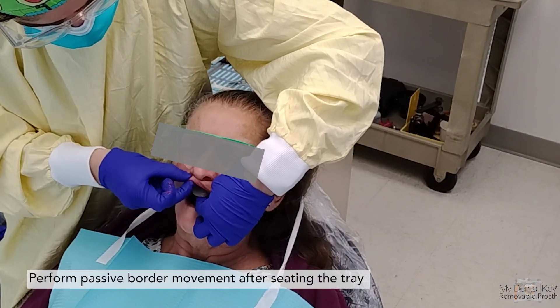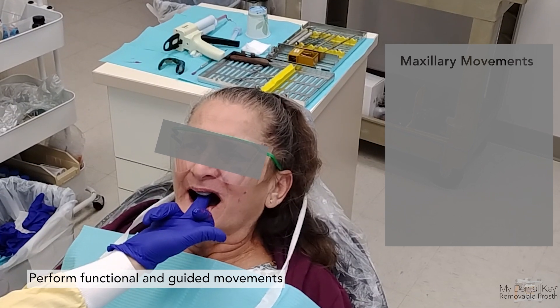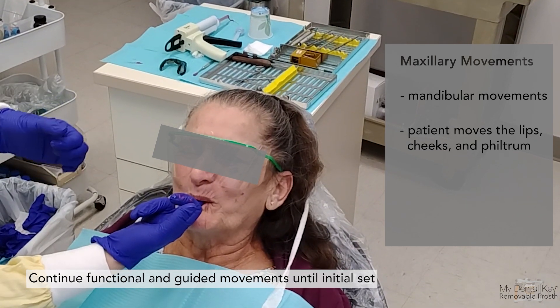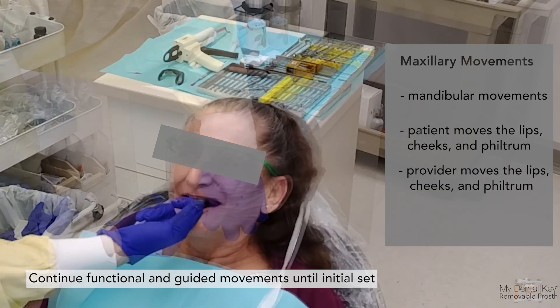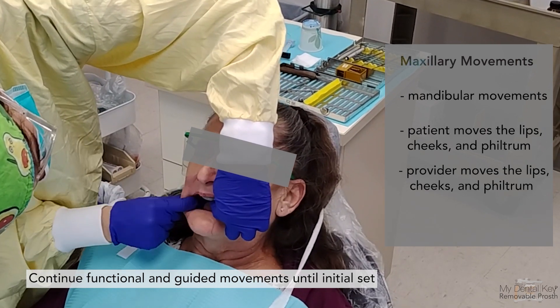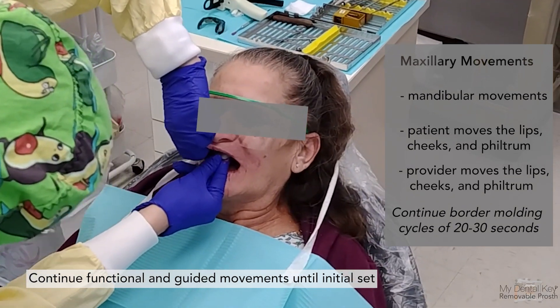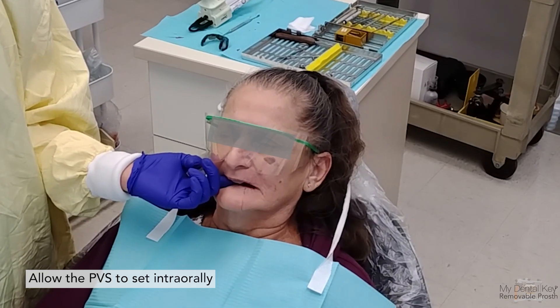Now mold and contour the impression material as it sets. Instruct the patient to move their mandible side to side, forward and back, and to open wide and close. Ask the patient to pucker their lips and smile as big as they can. Request that the patient bear down and blow out through their nose — you can hold their nose to increase pressure. Grasp the patient's philtrum and pull it upward, forward, downward, and side to side. For the cheeks, grasp and move upward, outward, downward, and side to side. Continue these border molding cycles of 20 to 30 seconds until approximately 2 to 3 minutes, then pause and ask the patient to relax as the material sets completely.